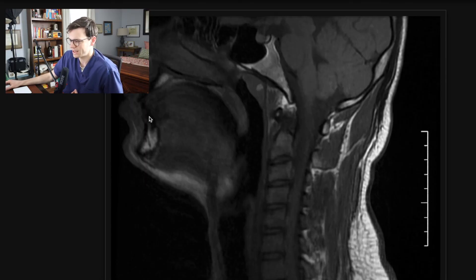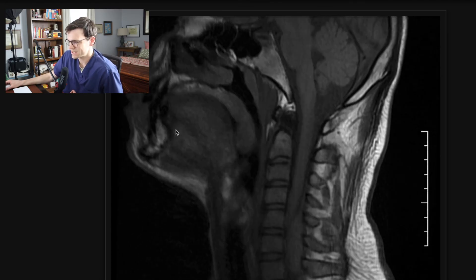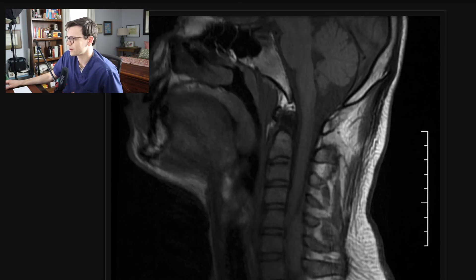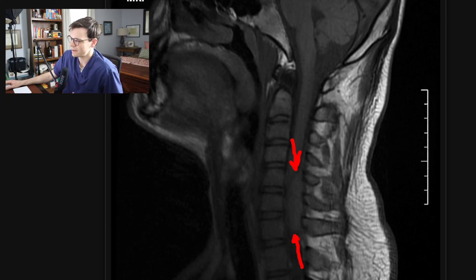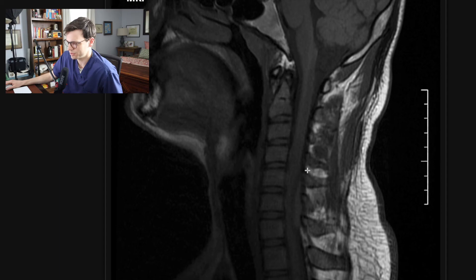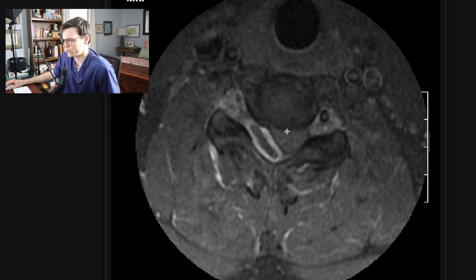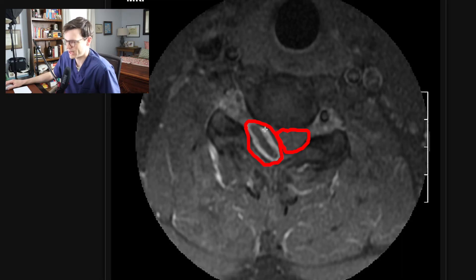I talked about always looking in the canal and looking at it in the different sequences. In this case, this is a sagittal T1 — we know it's T1 because the CSF is dark. As you can see, there's something abnormal between my two arrows here. This is epidural hemorrhage. This collection is actually contouring and pushing on the cord — you can see the posterior margin of the cord is being effaced by this collection. Now in the axial plane, we have something pushing on the cord; the cord is being displaced laterally to the left by this epidural hemorrhage, which has mixed intensity — bright and dark.